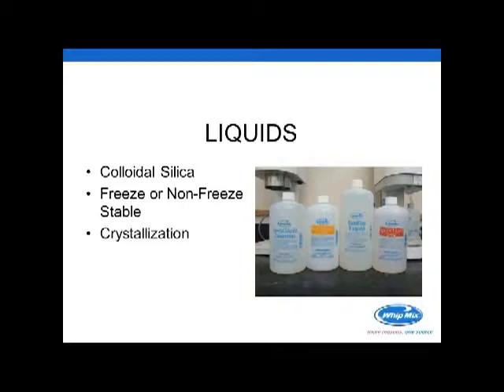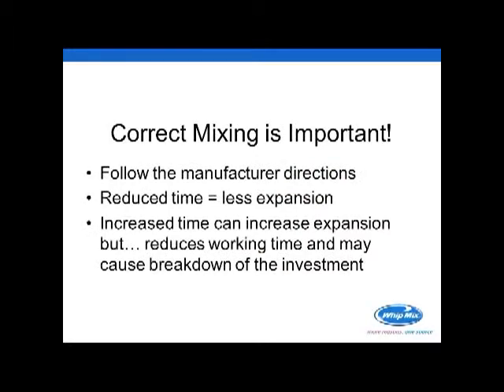All right, now correct mixing is very important. You need to follow the manufacturer directions because it will change the chemistry that's involved in your investment. If you reduce the mixing time, you will get less expansion. If you increase the time, it can increase the expansion, but it also can reduce the working time. And also, if you mix too long, it may cause a breakdown of the investment.